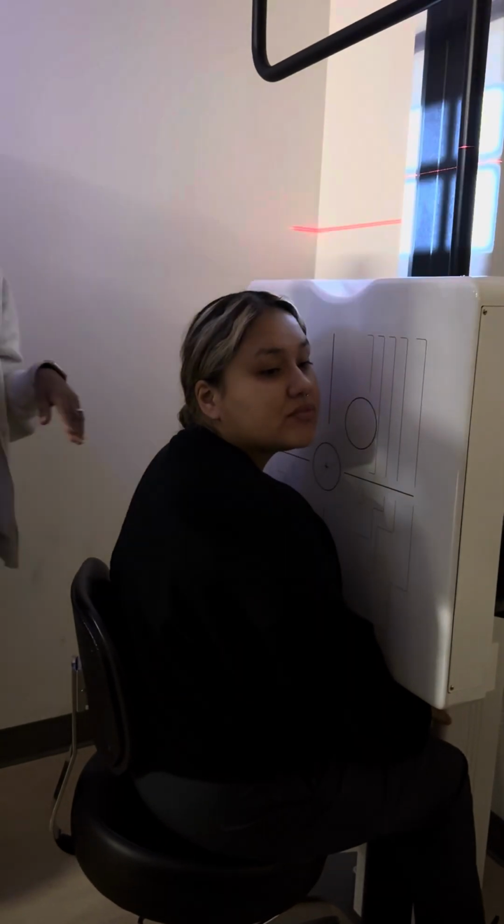Can you show the first one you showed? The first one was a lateral. Can you show that one again? I can. Okay. She can show me, actually. We'll do it together. What changed with this lateral as opposed to the previous lateral? The skull lateral is what? 2 inches above the EAM, right?